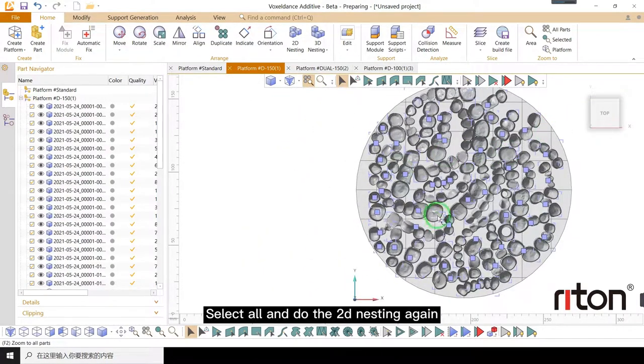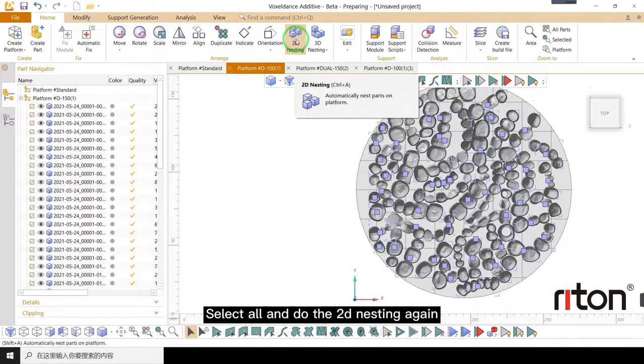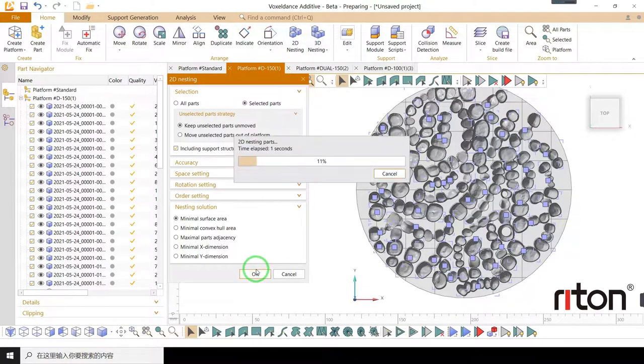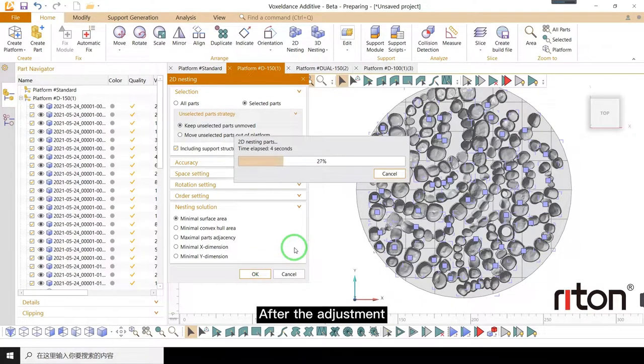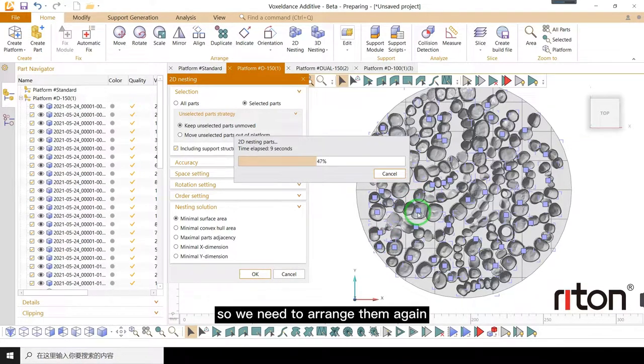Select all and do the 2D nesting again. After the adjustment, some parts will collide with the adjacent parts, so we need to arrange them again.